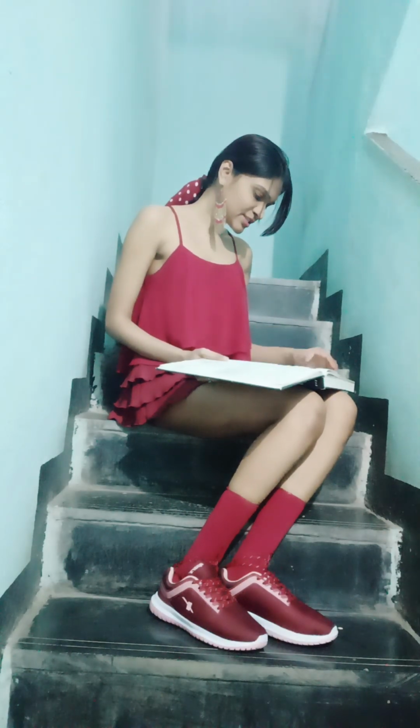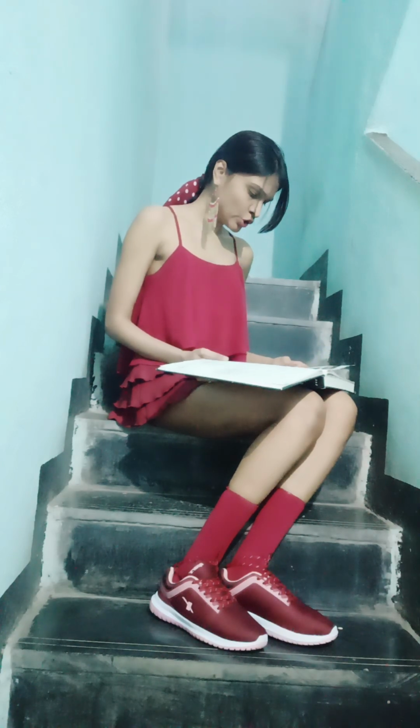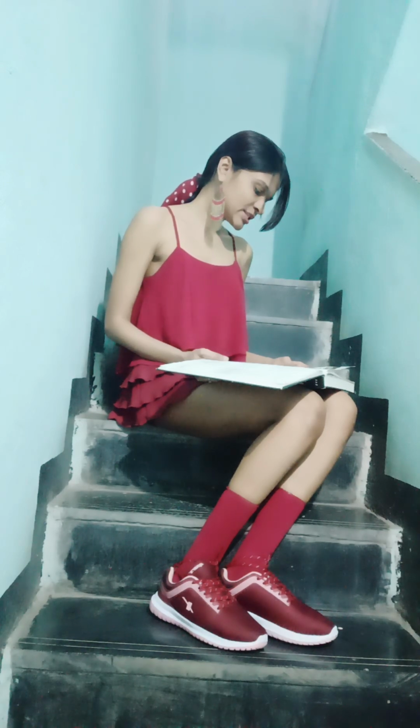Normal blood vessels. Blood vessels are normally not seen in the angle, although loops from the major arterial circle may appear in front of the ciliary body band and less commonly over the scleral spur and trabecular meshwork. These vessels typically take a circumferential route in the angle.